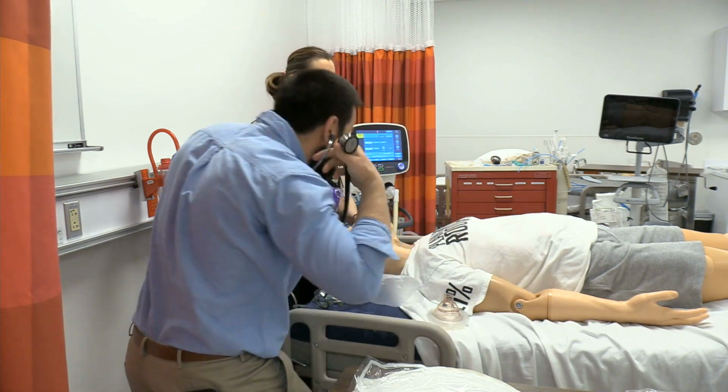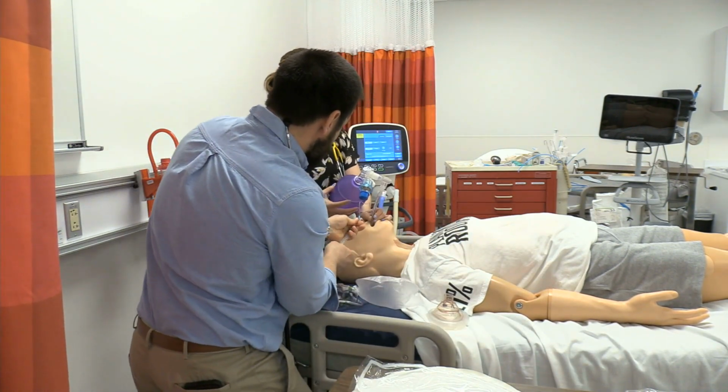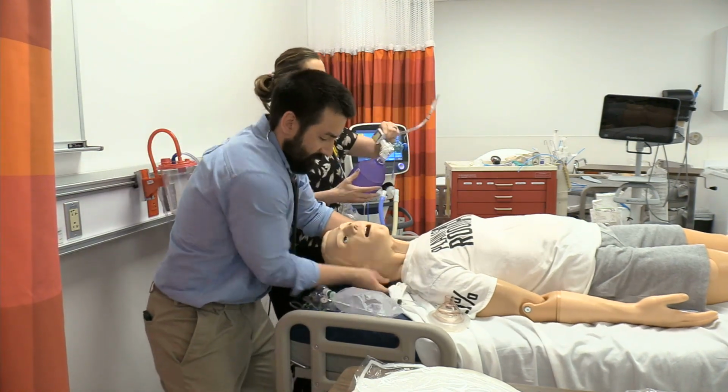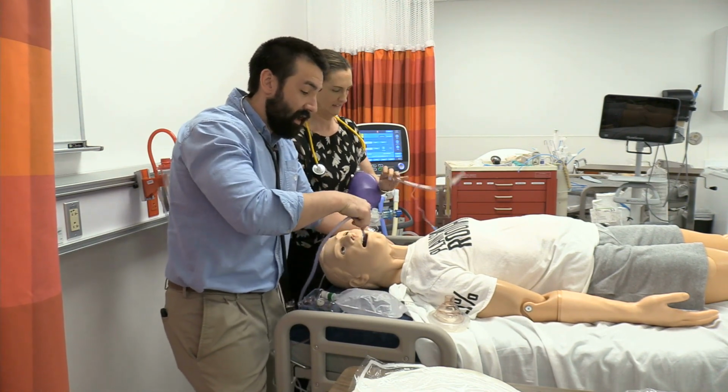Oh, we're in the stomach. No, oh, hang on. Okay. Oh, what do I do? Wrong hole there. Whoops. Hang on a second. Go ahead, pull that tube. Alright. Let's turn them. Ugh. A lot of times they vomit. We've got to roll them over and suck some of this stuff out.